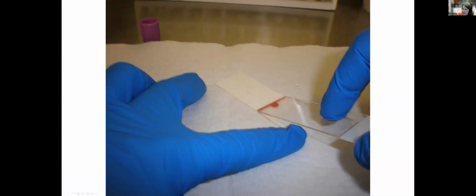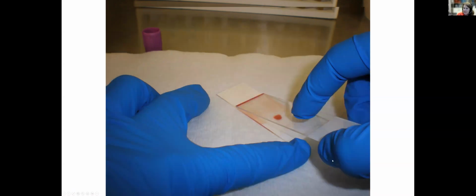So here is a technologist who is making this thin film. She put that little drop of blood on the slide. She's now using a second slide, pulls back, lets the blood pool all the way along the edge of the slide, and then in one continuous motion, pushes the blood film out. So the end result will have this fine feathered edge. And this is important because this is the area where you're going to be examining the blood slide for potential parasites. Now, where you examine on the blood film is important.